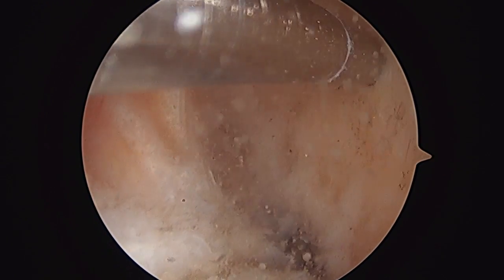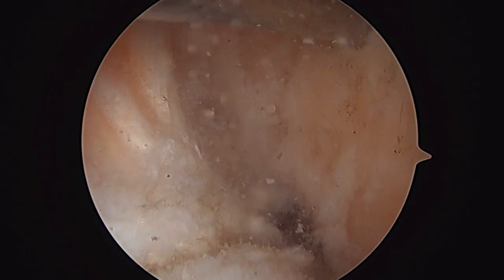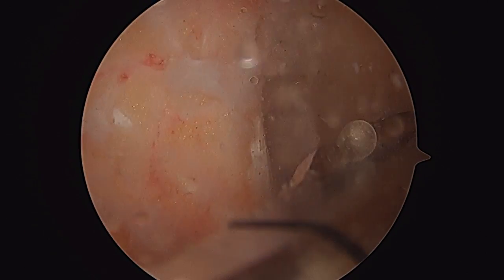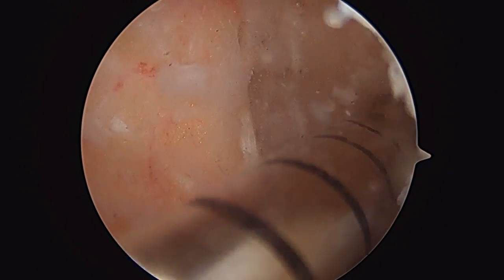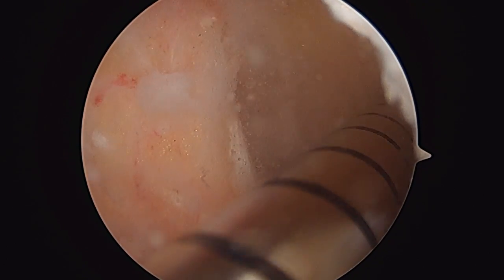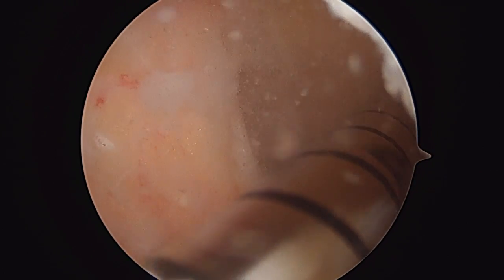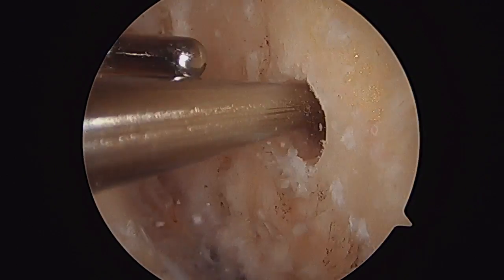So in this case, I'm drilling a standard guide pin through the area I've selected with my awl. This technique, I don't use any type of guide or over-the-top localization for this. I then come over the guide pin with a 4.5 drill bit, and this drill bit I'll use to start the tunnel and go out through the outside cortex. That's important to allow movement of the pin. Also use this to gauge the depth of this tunnel. As it goes through the outside cortex, you can see how deep it is.